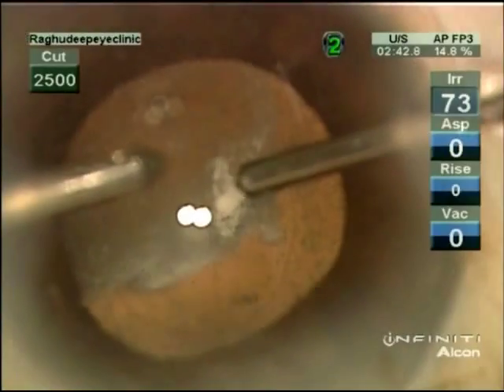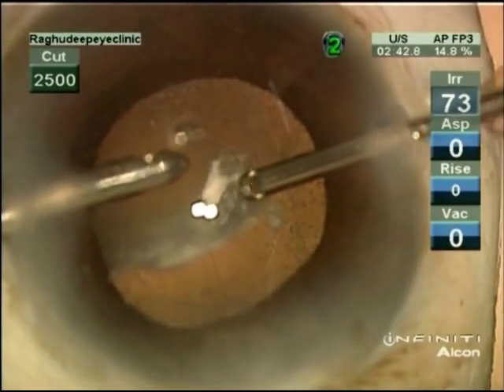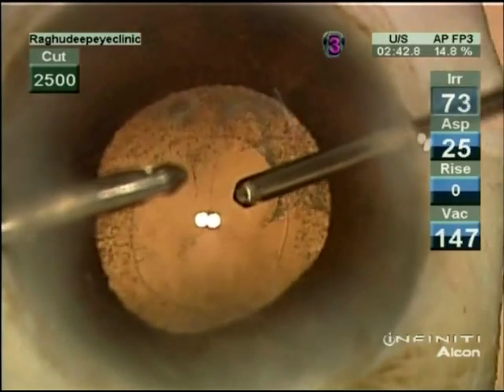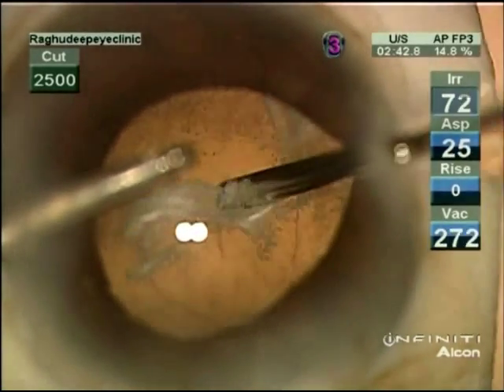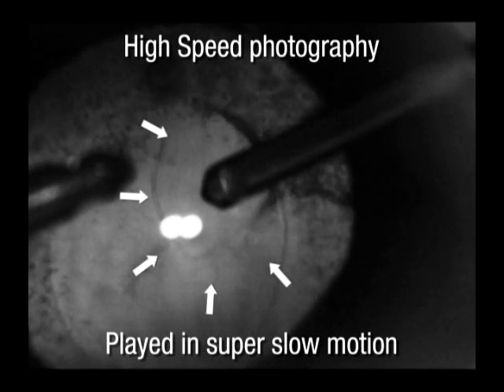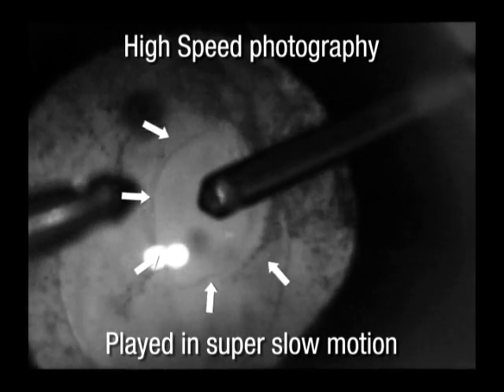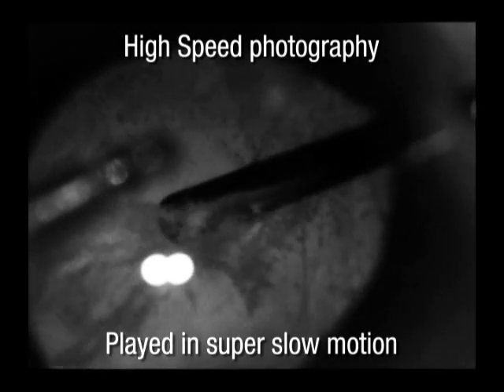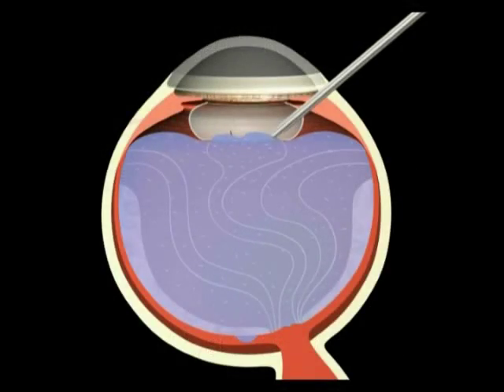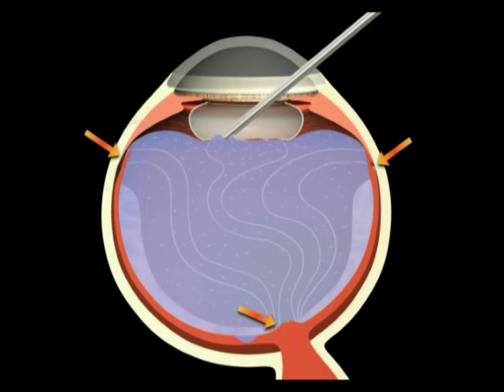When we perform anterior vitrectomy from the limbal route, we are attacking the prolapsed vitreous from above. Now this vitreous is still attached to the central vitreous body below the tear. So even with a high cut rate, the aspiration forces cause a drag on the larger vitreous volume lying underneath the posterior capsule. This super slow motion video captured by high-speed photography shows very effectively how the turbulence in the anterior chamber and the upward drag of the central vitreous body is too much of an onslaught. These forces extend the fragile margins of the tear in the blink of an eye. Additionally, this can also cause traction on the vitreous base and the macula, with sequelae that can be more serious.